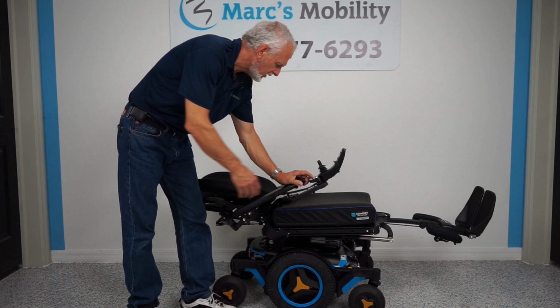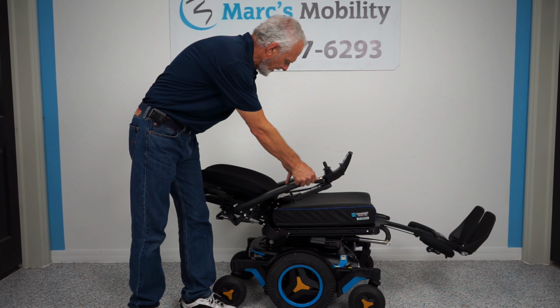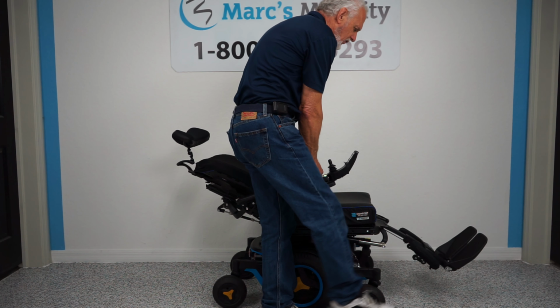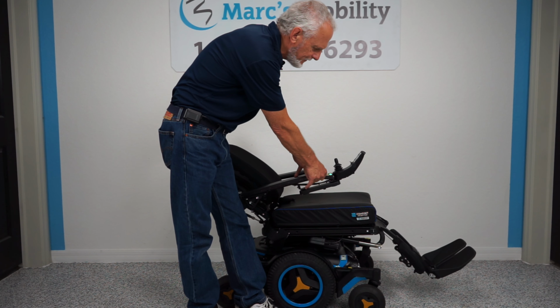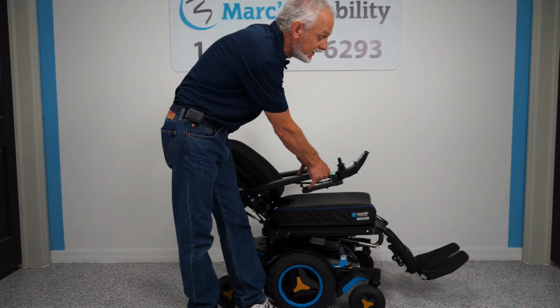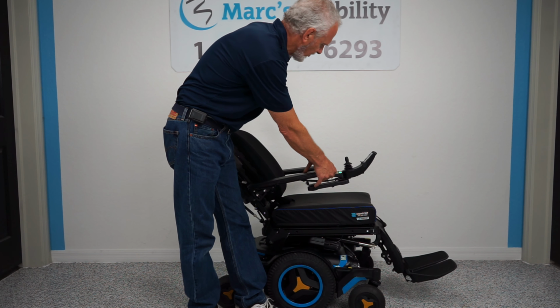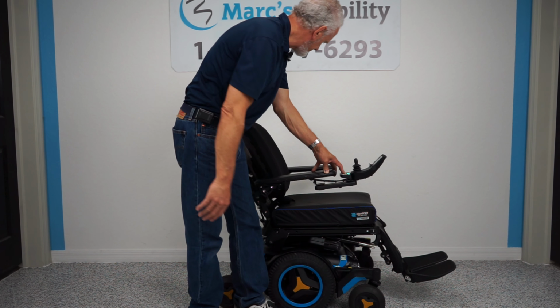So I'm going to bring the recline back up and the feet back down. I'm doing 2 buttons at once. And you can see. So when you're outside, make sure you keep your feet up in the air a little bit so you have more ground clearance. You don't want to be jamming those electric feet into a curb or anything like that. These are already pretty high on this chair because the feet are set up a little high on that one because the person was short. So if you're a taller person, the foot plate would come down more.